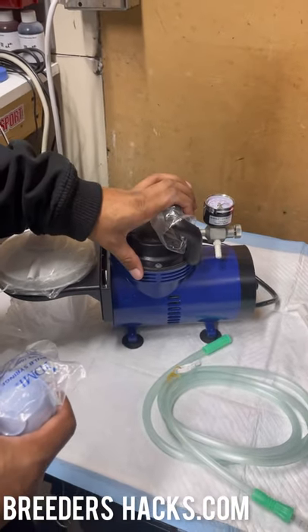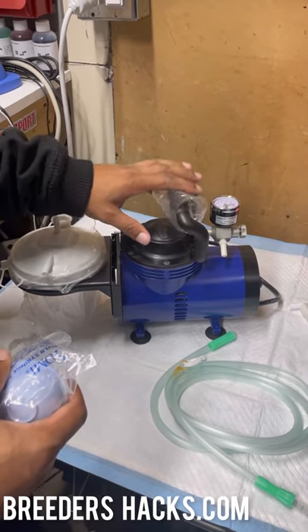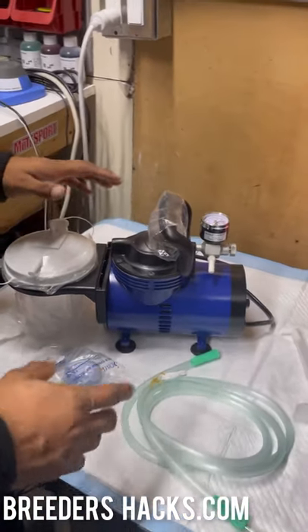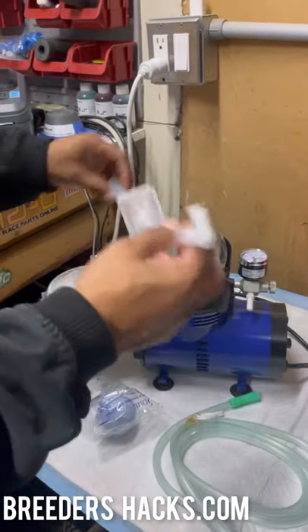You would actually have to intentionally harm the puppy — it's definitely safe. Let me run through this machine and show you guys real quick. This here is the compressor.